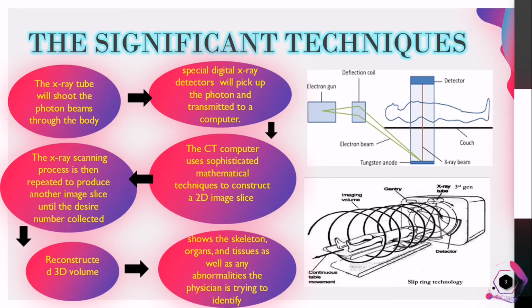Next, the reconstruction of the 3D visualization image. And lastly, the observation of the skeleton, organs, and tissue, as well as any abnormalities the physician is trying to identify.